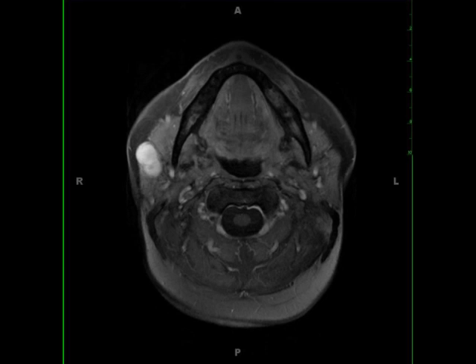Worrisome imaging features include infiltrative margins, multicentricity, or regions of hypointense T2 signal intensity.